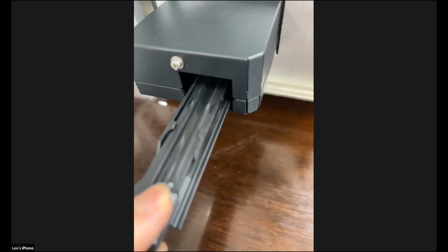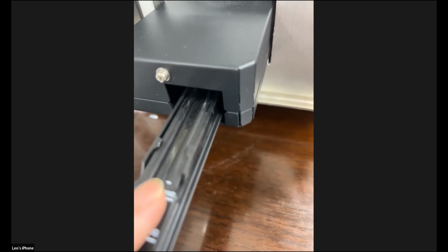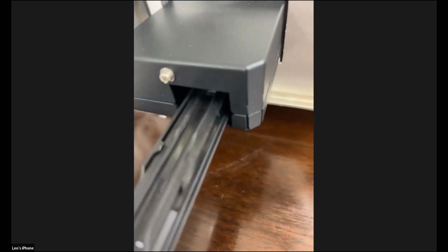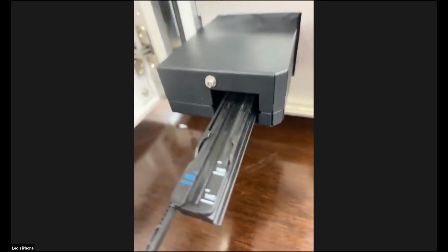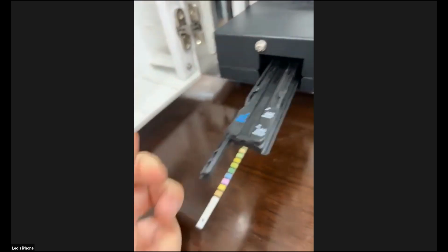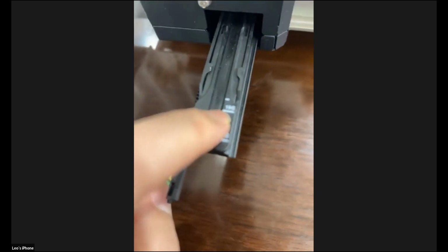You can hear a sound as the mechanism fixes the slide. The magnetic module will fix the slide, and then next time when you place the strip, you can see different marks showing the different types of strips.